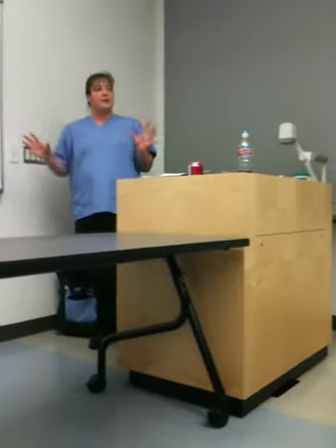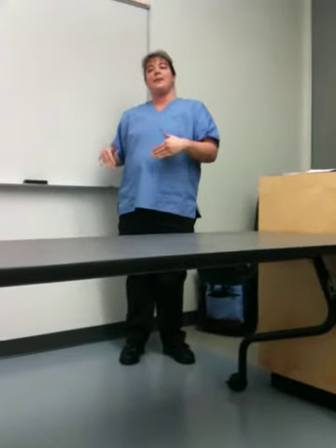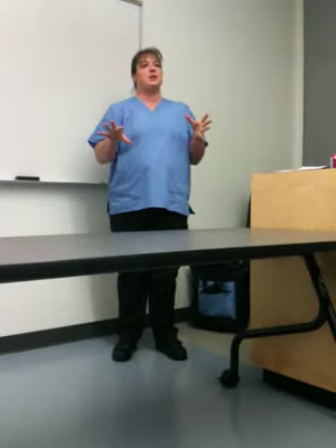So I just want to clarify with everybody. The station is you're operating the AED and you're managing the other imaginary people that are there. One of the first things I want to clarify, because it is a little different from some of the information presented in the book, is you don't ever check breathing and pulse in this station.